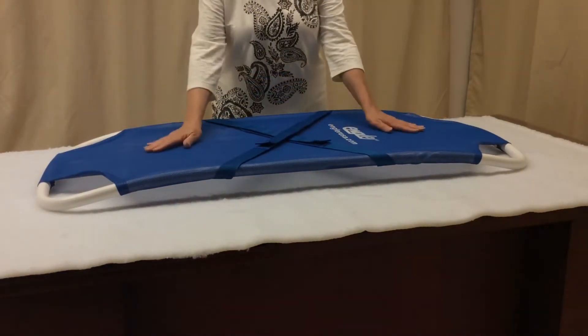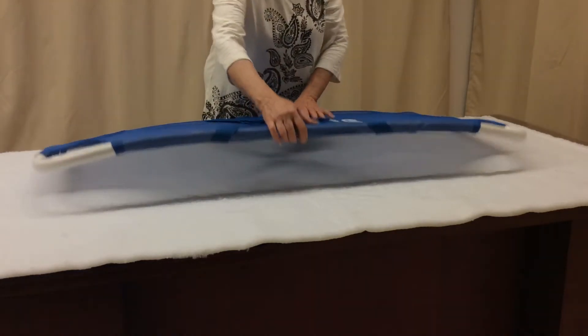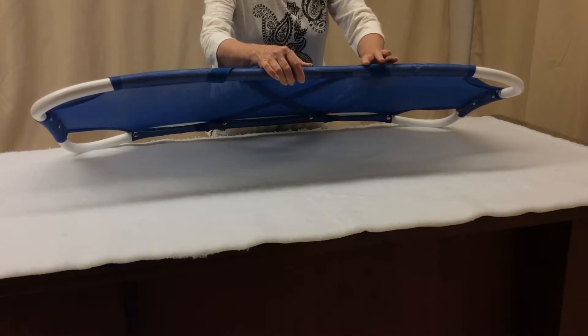It can be washed with soap and water. If the mesh needs replacing, just unsnap it and replace it with a new one.